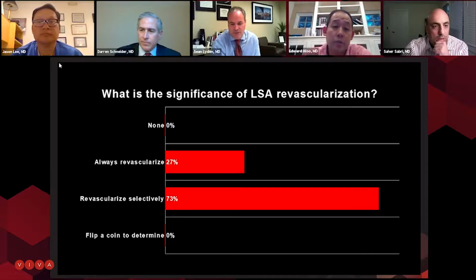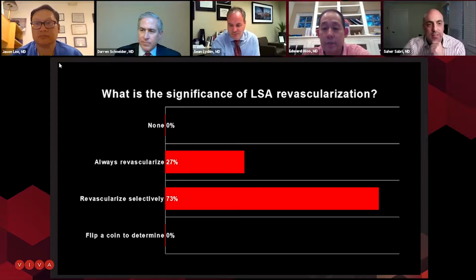It's interesting, probably about 10 years ago, maybe even a little earlier, when we really started getting aggressive with the TEVARs, there was a lot of controversy, right? Lots and lots of papers were written about left subclavian artery revascularization, whether it was necessary or not. And for the most part, as everybody on the panel has said, we've moved towards revascularizing pretty much everyone on an elective basis when we can.